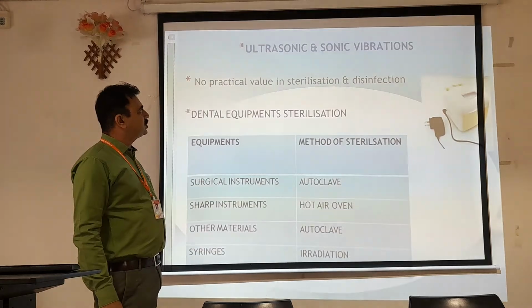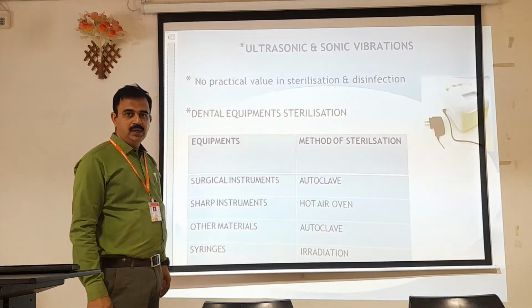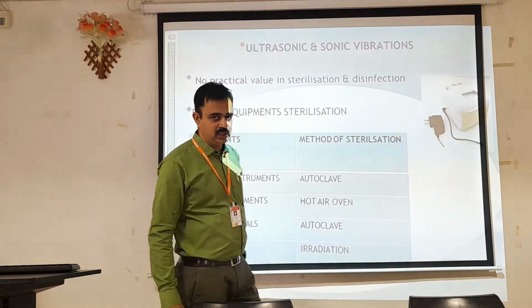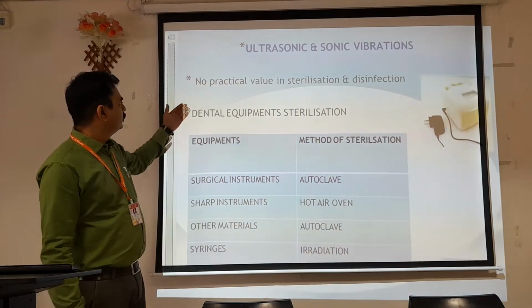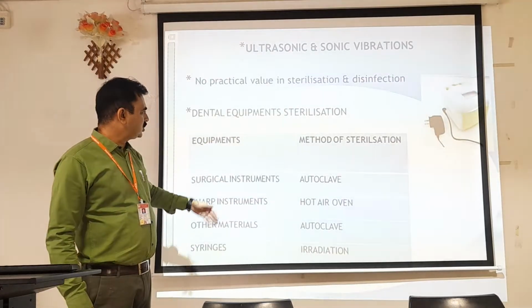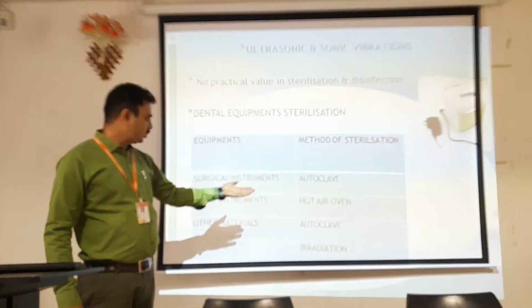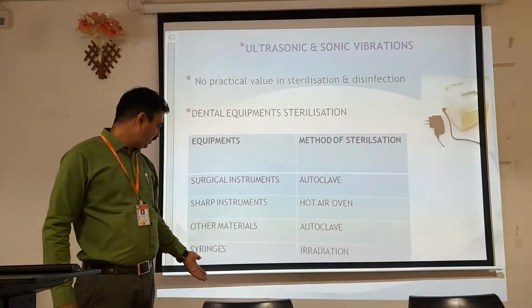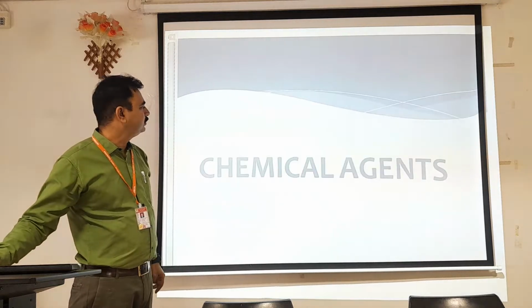No practical value in sterilization and disinfection. Ultrasonic and sonic vibrations are also there, by which sterilization can be achieved. Then, dental equipment sterilization: instruments, surgical instruments, autoclave; sharp instruments, hot air oven; other materials, autoclave; and syringes by irradiation can be utilized.